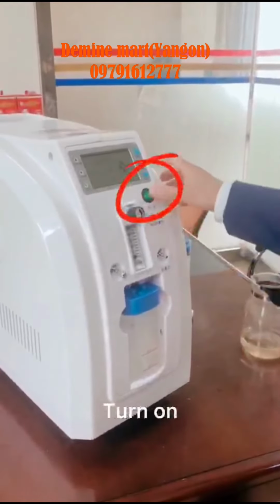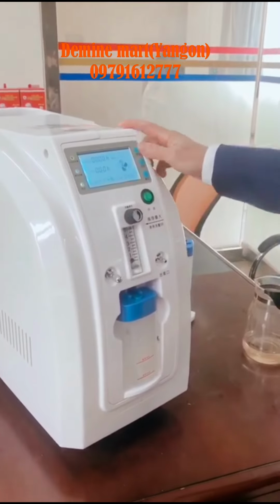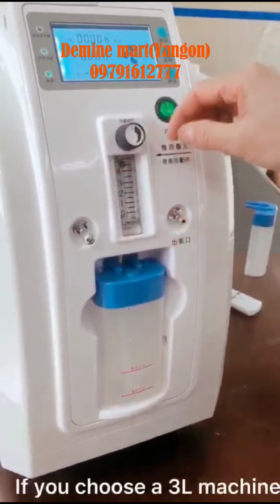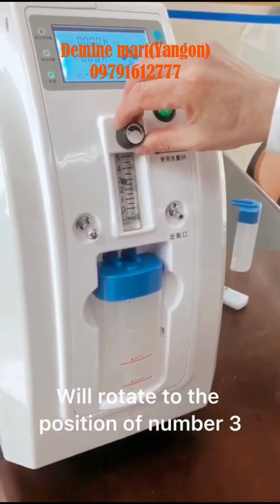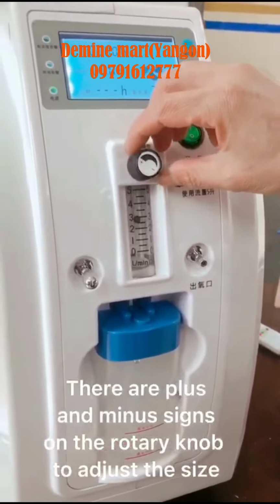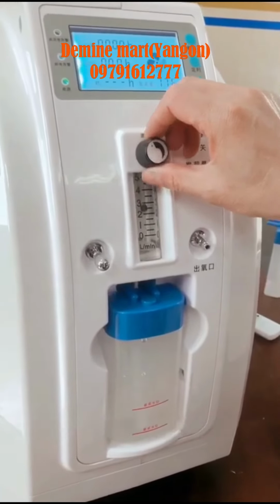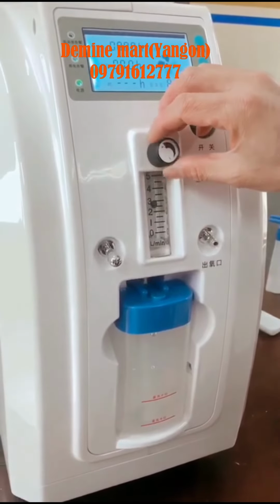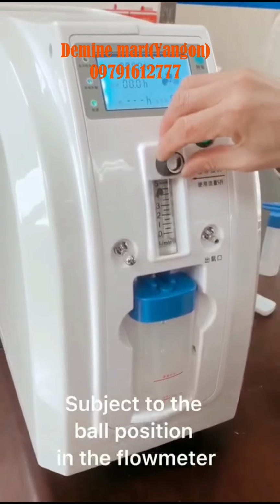Turn on. Press oxygen. The ball of the flow meter will start to move. If you choose a 3 liters machine, we rotate to the position of number 3. There are plus and minus signs on the rotary knob to adjust the size. If you buy a 5 liters machine, we rotate to the position of number 5. Subject to the ball position in the flow meter.